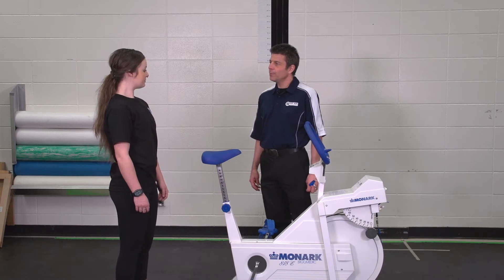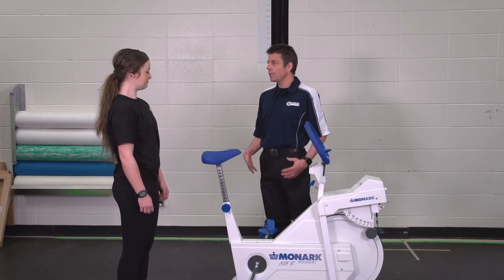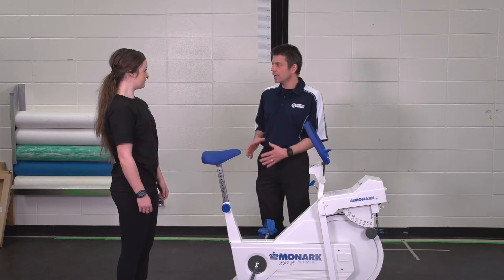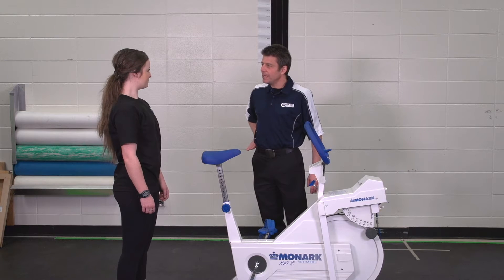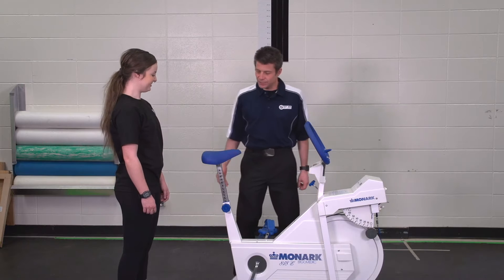So the first thing we're going to do before you get on the bike is adjust the saddle and make sure that it's the right height for you. What we're looking for is just a little bit of a bend in your leg — not quite fully extended but not a big bend either. I like to put the saddle at about hip height, and that seems to be about right, but we'll have a look and see once you're set up.